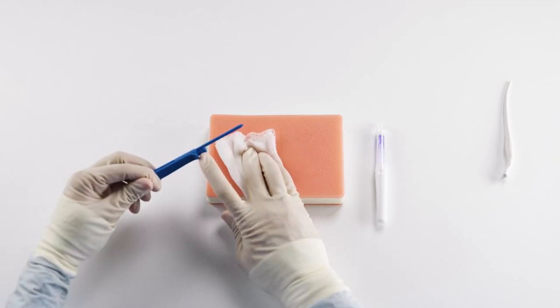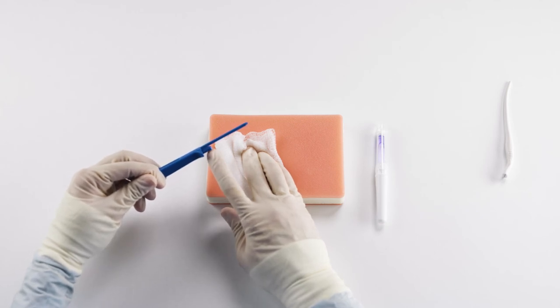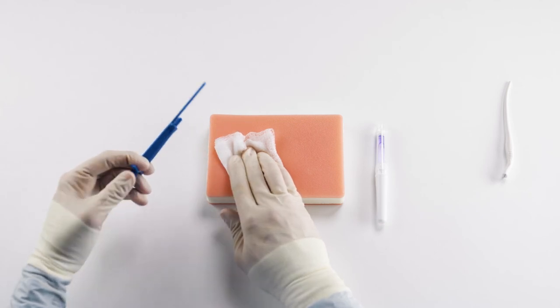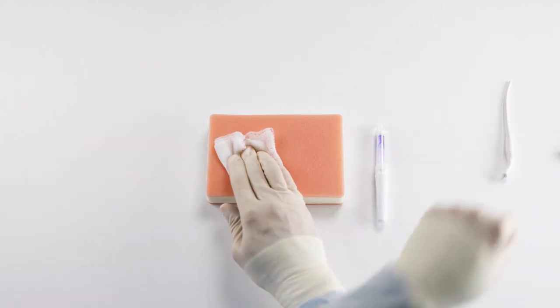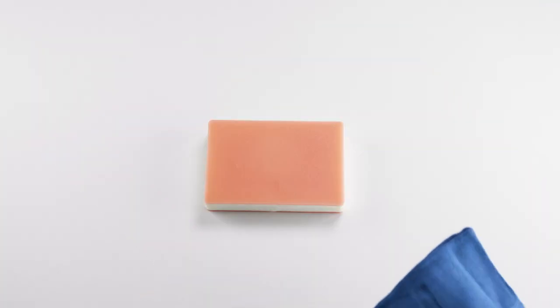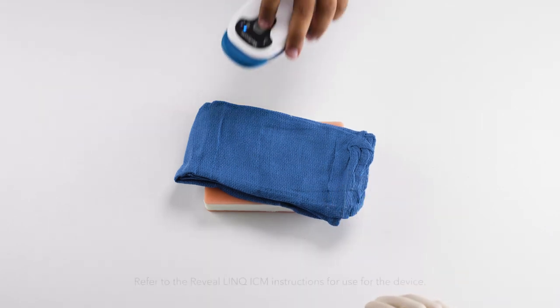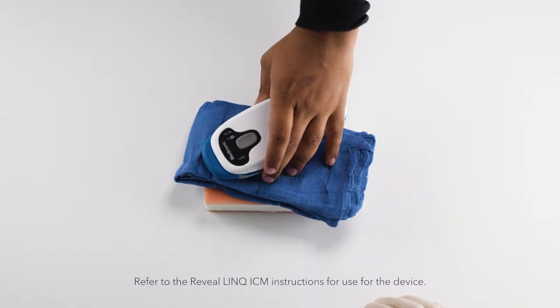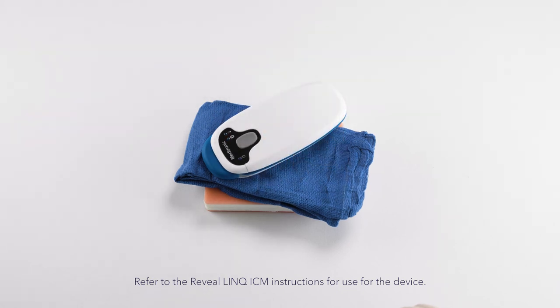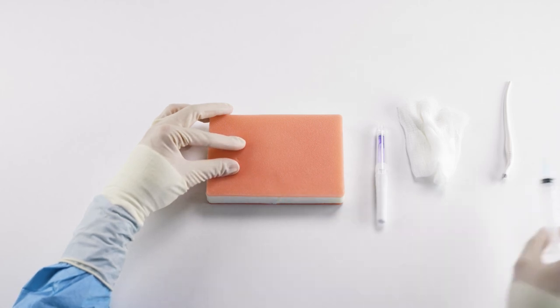As you can see, the Medtronic RevealLink has been inserted approximately 10 millimeters away from the incision, so you can be reassured that the device will not pop out easily. I'm going to hold pressure here for a moment to ensure bleeding is controlled. Prior to closing the incision, I'm going to apply a sterile towel on the patient's chest, and a team member will apply the Medtronic reader head onto the patient's chest to ensure the R-waves are above 0.2 millivolts. I'm told the R-waves look good, and if needed, you can always inject 1 cc of lidocaine with epinephrine on the surface to control any bleeding.